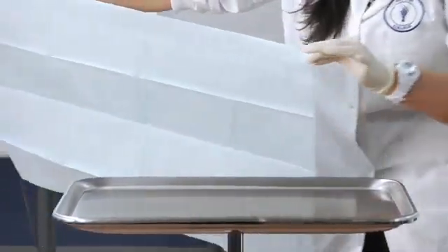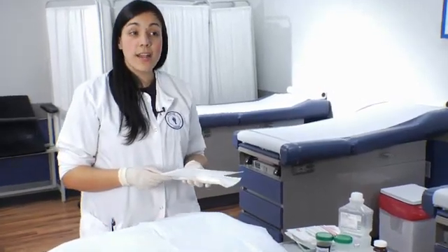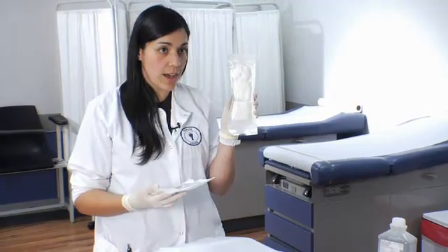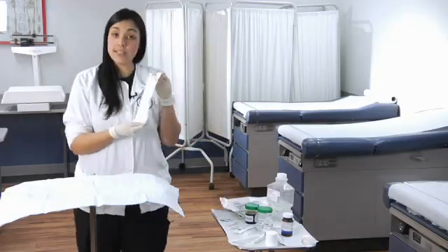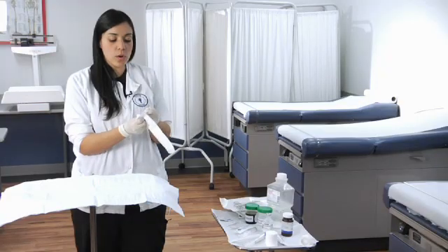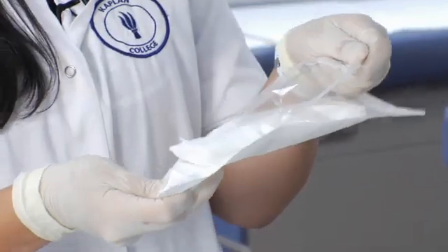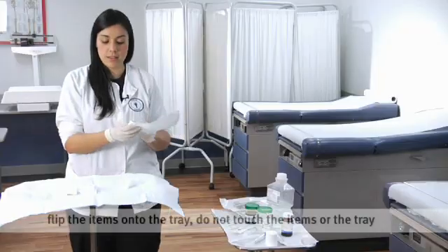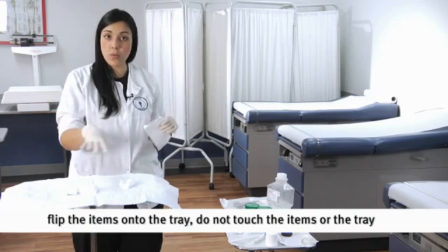The blue is always going to go towards the bottom, the white on top. Now I'm going to demonstrate what is actually going to be placed onto your sterile field: sterile gauze and sterile instruments. I'm going to start off with the sterile gauze. When you open up this autoclave package, you want to make sure that you don't touch the contents inside because it's all sterile. When you open it, you just kind of want to flip them onto the tray — not reaching over or touching them because you don't want to contaminate your field.